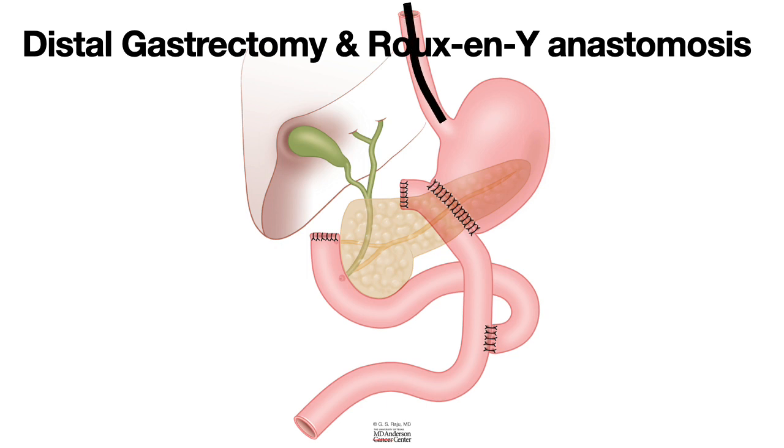So the endoscope goes down the esophagus, stomach, first anastomosis, second anastomosis, afferent limb to the ampulla. It's a long circuitous route, and these procedures are technically challenging. So it's important to allot a decent amount of time when performing these cases where there is altered surgical anatomy.